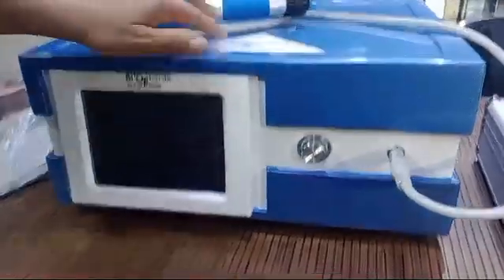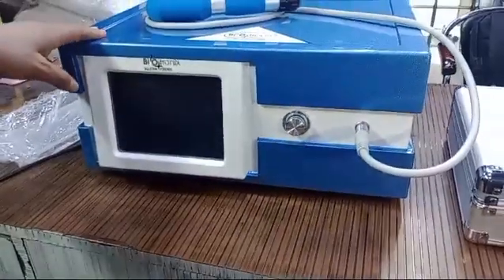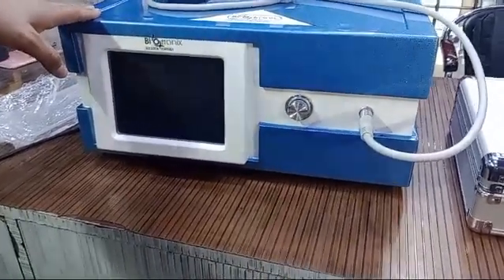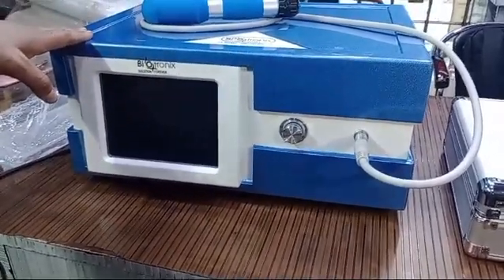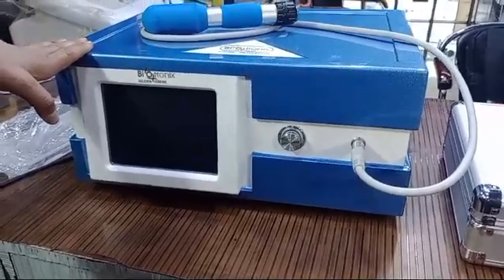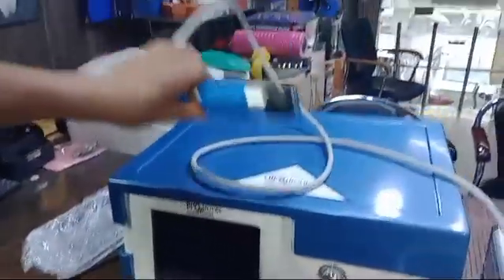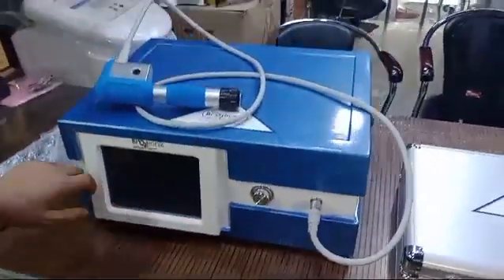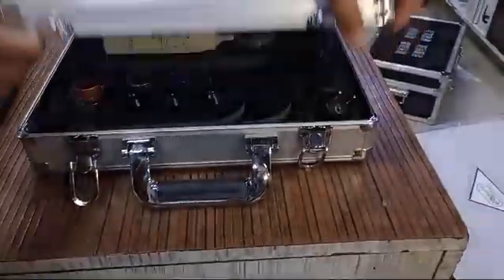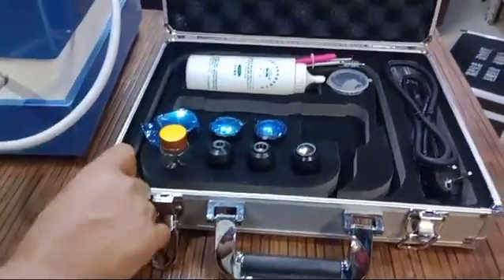This is Biotronix pneumatic shockwave therapy — extracorporeal shockwave therapy and radial shockwave therapy. The maximum power is 10 bar. You can see the probe, the display, the accessory case, and the air compression base of this pneumatic shockwave device.